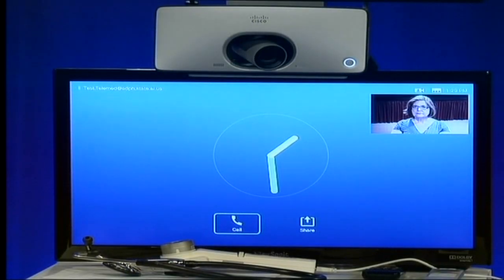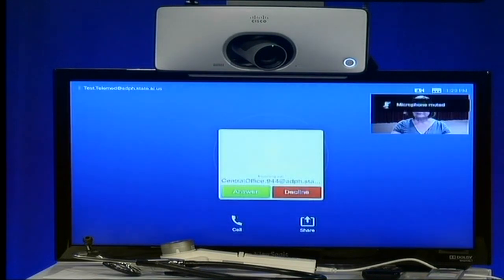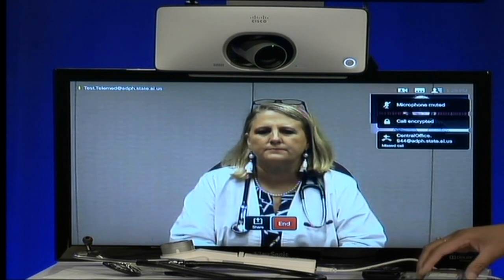The doctor is now going to call the cart. As you can see, the cart automatically answers, but answers on mute. Unmute by pressing the unmute button on your silver remote.